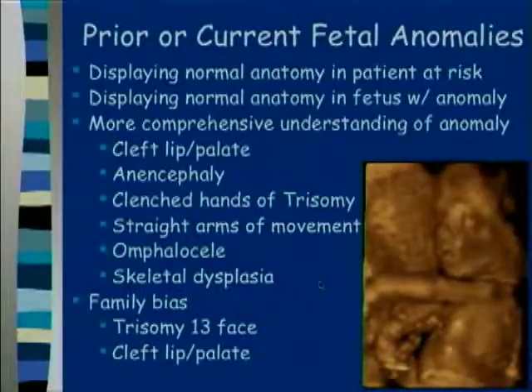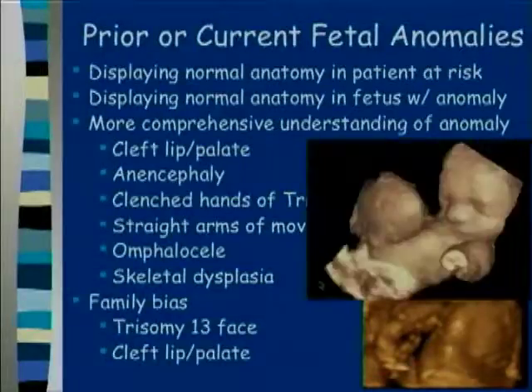I would comment that some families will have a bias in how they look at the pictures, and I know I had one patient that had a very flat midline cleft in the face, and the family thought the 3D pictures looked quite normal, and when they saw the baby at delivery, they were just horrified because it didn't look anything like what they thought the 3D picture looked like. Also, I've had cleft lips be both directions. Some think it looks worse, some think it looks better than they anticipated.